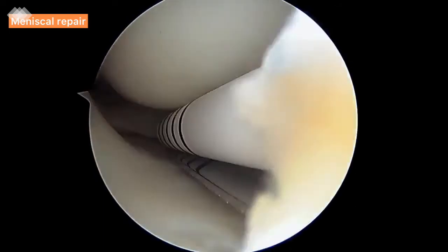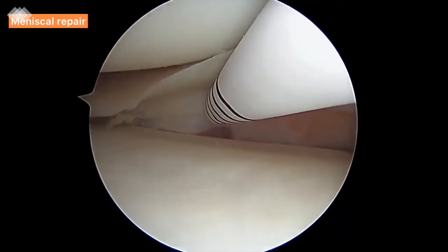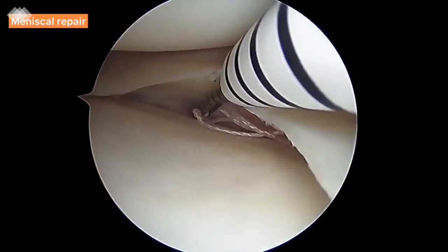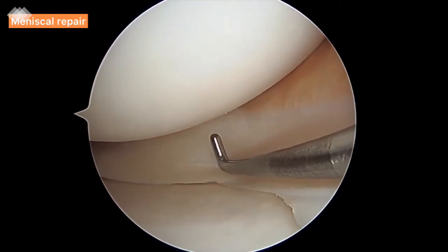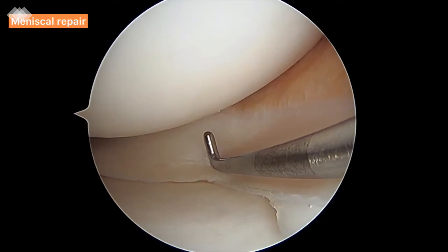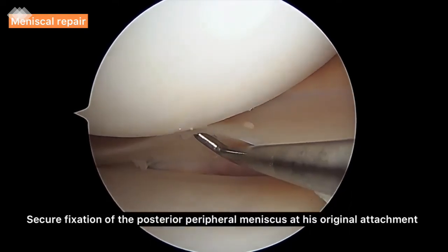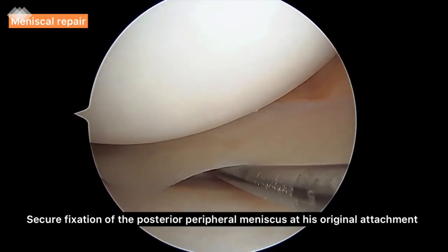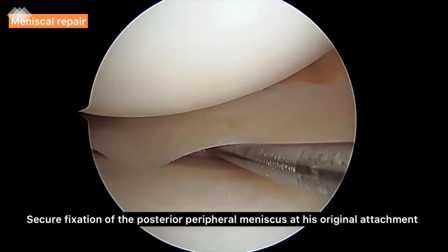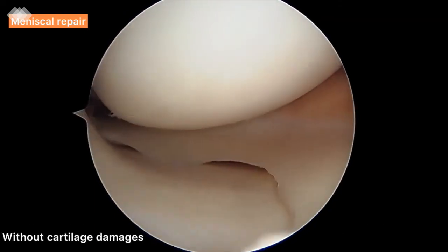We repeat the same suture as many times as necessary. We achieve secure fixation of the posterior peripheral meniscus at its original attachment. Therefore, the inferior facet of the meniscus can no longer be reversed. There is also no noticeable cartilage damage after the repair procedure.